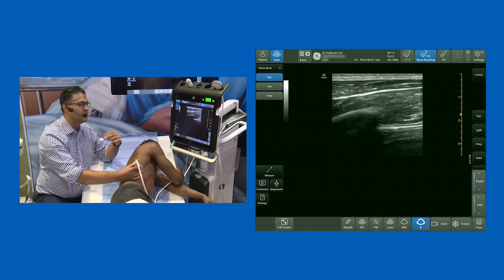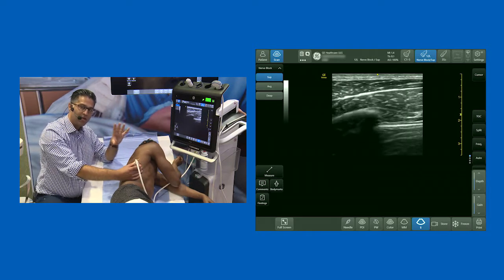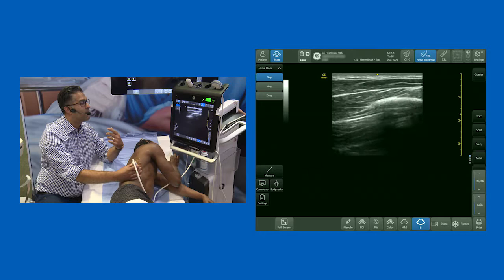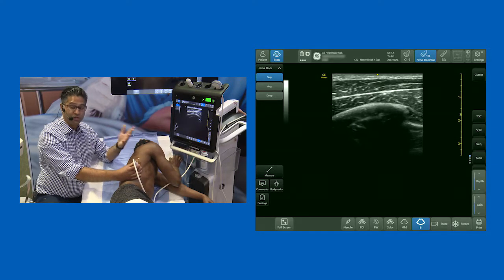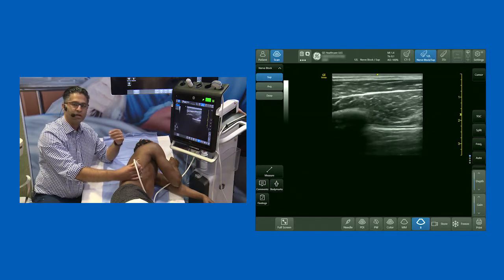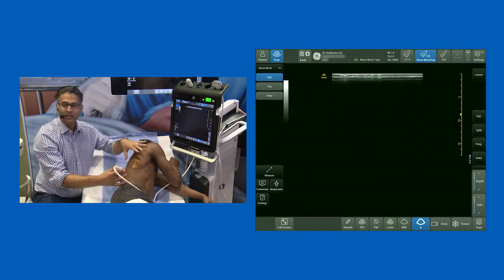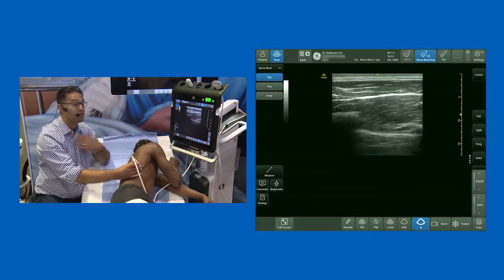I'm going to do a serratus plane block. This has indications for breast surgery — though if you do a serratus plane block in isolation, you won't take out the medial and lateral pectoral nerves, so bear that in mind for your analgesic strategy. The biggest indication and utility is rib fractures. This is great if you're providing a trauma or out-of-hours analgesic service, except in one indication: surgical emphysema — because if they've got surgical emphysema, you're effectively wasting your time.